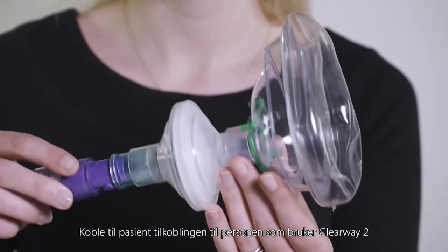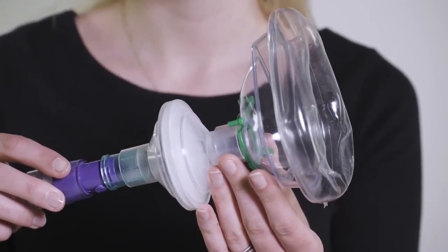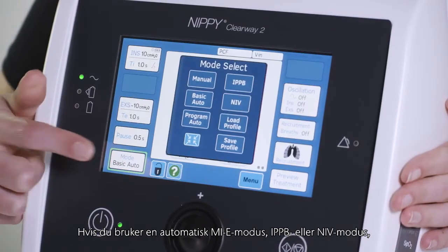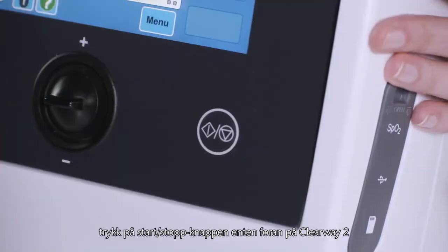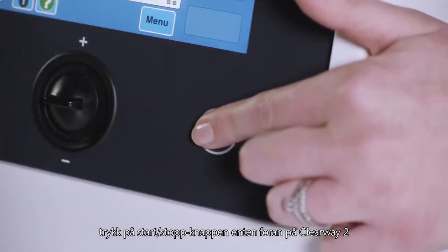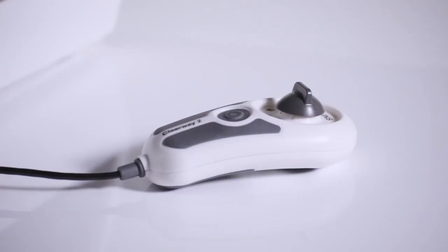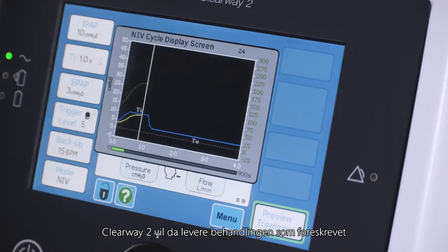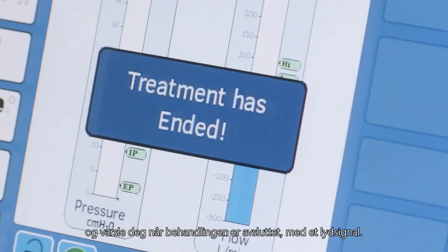Apply the interface to the person using the Clearway 2 as instructed by your clinician. If using an automatic MIE mode, the IPPB or NIV mode, press the start stop button on either the front of the Clearway 2 or on the handheld control if you have one. The Clearway 2 will then deliver the treatment as prescribed and alert you when the treatment has ended with an audible beep.